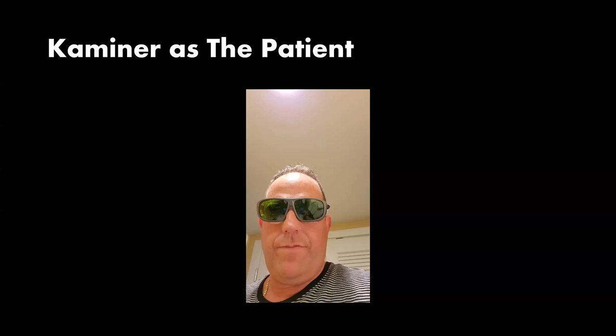I was at an Ultradent key opinion leader meeting in Utah, and I broke out with a herpetic lesion on my lip. So I reached out to the key opinion liaison, Jason. I said, I need a diode. I'm going to treat myself and I'm going to video it. So now imagine me with my laser glasses on. You'll see I'm going to use the diode to treat my lip. I'm looking at it in the bathroom mirror in the hotel and recording it in the other hand.